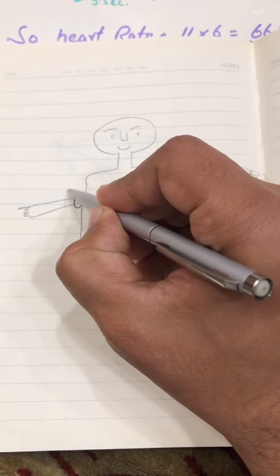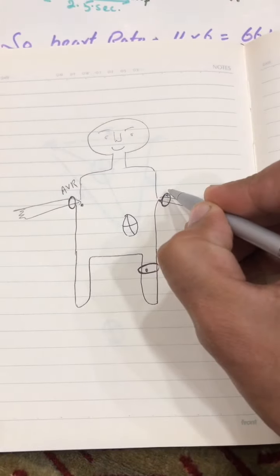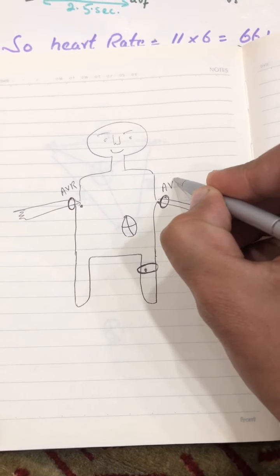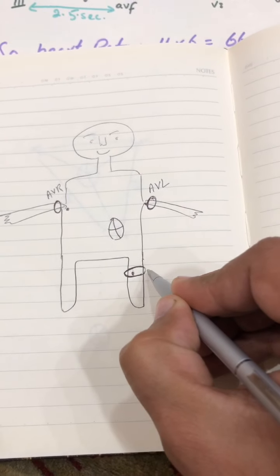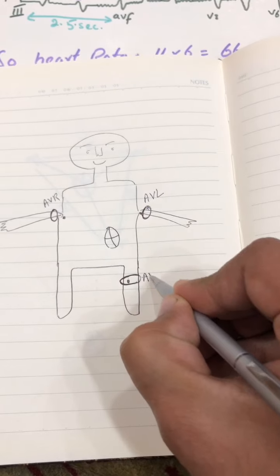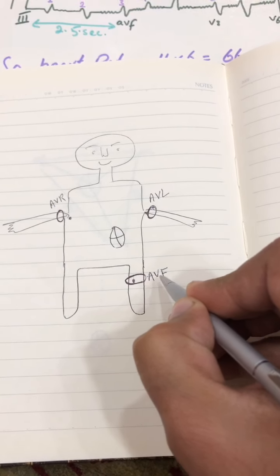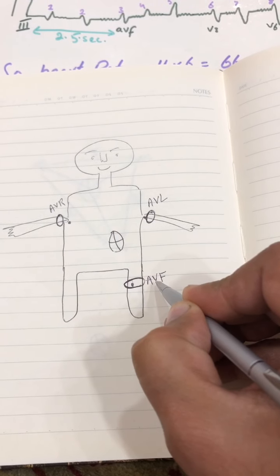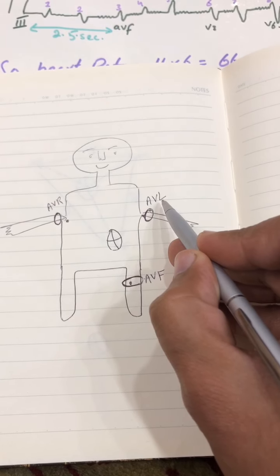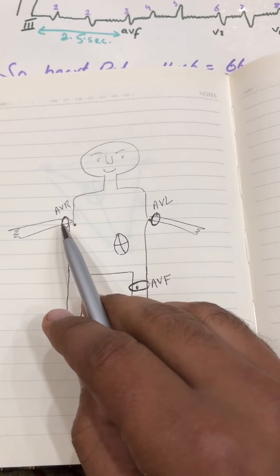See, we will call it AVR, the lead which is connecting to the right hand. The lead which is connecting to the left hand should be called AVL, and the lead connecting to the left foot is AVF. A means augmented, V means voltage, and F means foot. Augmented voltage foot limb lead. Okay, augmented voltage left limb lead. Okay, augmented voltage right limb lead.